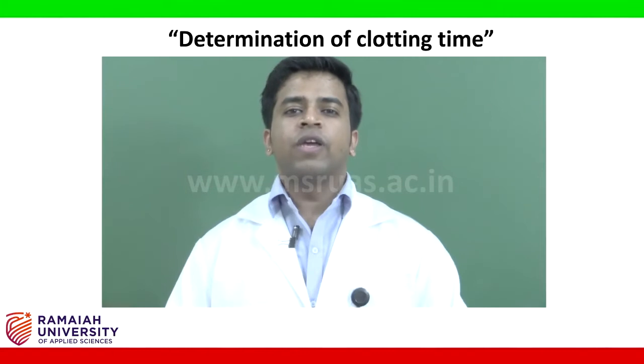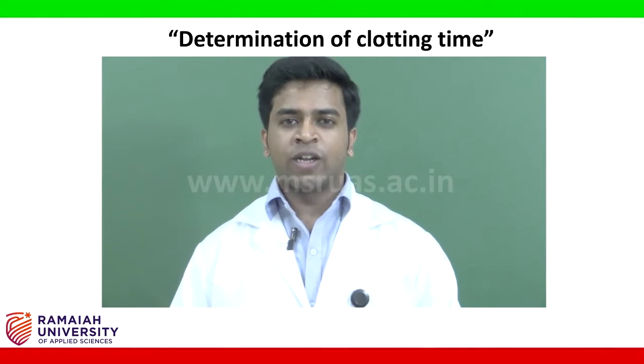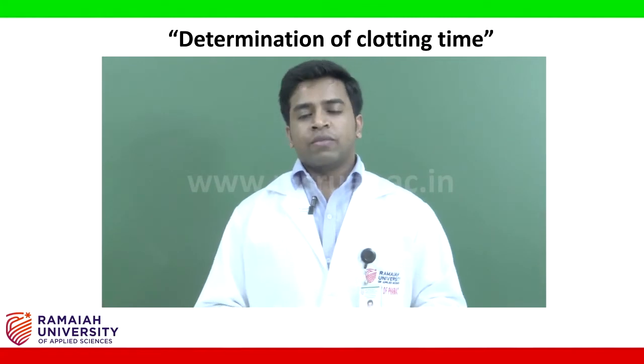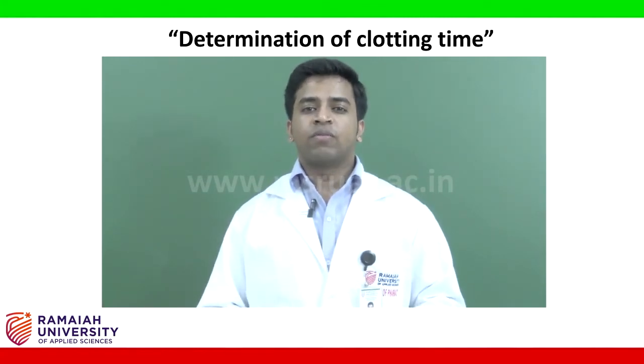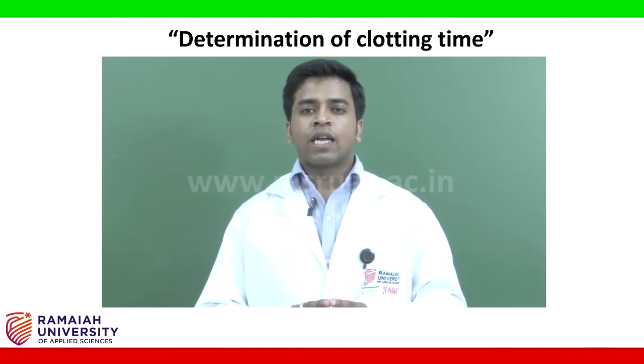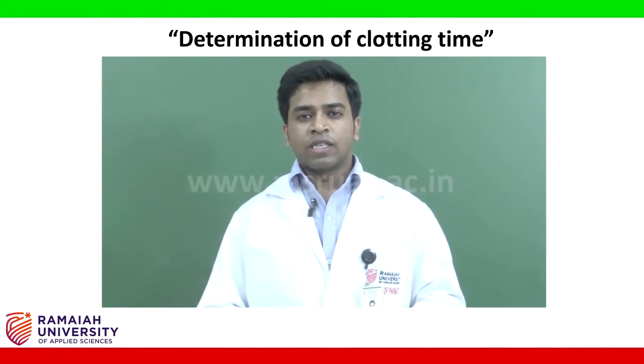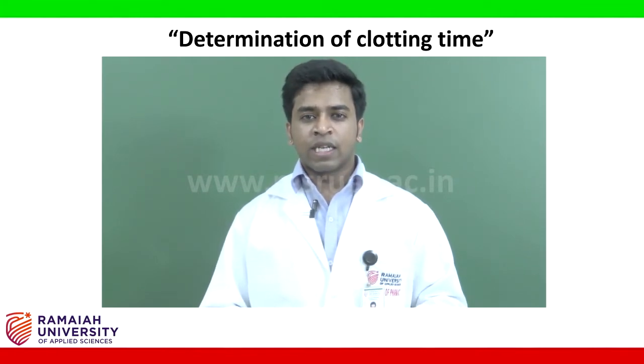Hi students, today we are going to study clotting time. The aim of this experiment is to determine the clotting time and to assess the problems related to the clotting mechanisms. Clotting time is the time interval between the entry of the blood in the capillary tube and formation of the fibrin threads. The purpose of this experiment is to aid in the diagnosing of various clotting disorders or coagulopathies such as thrombocytopenia, vascular defects or vascular abnormalities, platelet defects, and von Willebrand's disease.